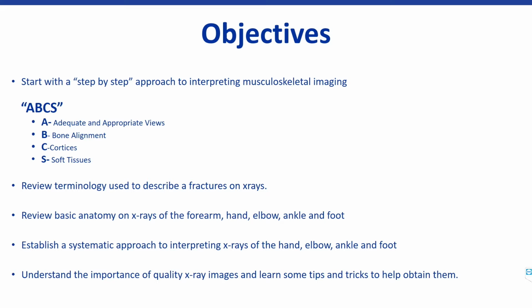They can lead you to further hone in your exam and evaluate a certain area that you may need to look at that didn't really look all that suspicious initially on the x-ray.